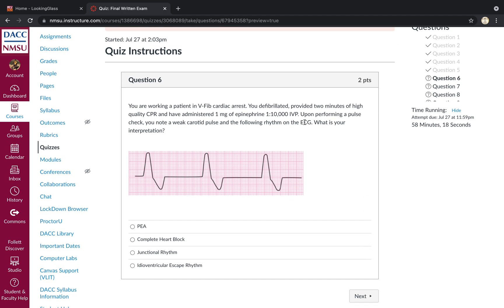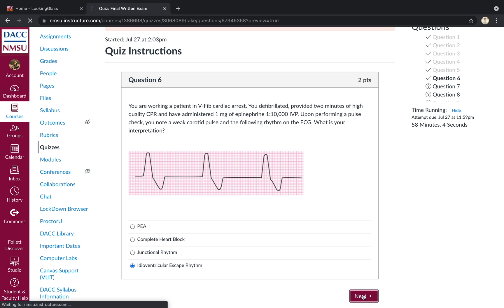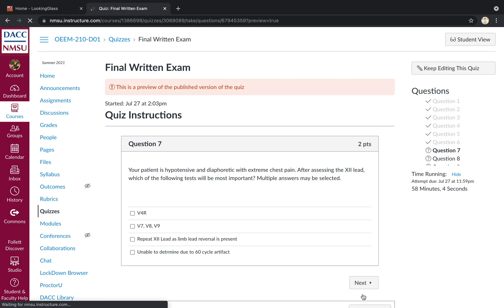V-fib arrest. You've defibrillated the patient, done CPR, given epinephrine. Perform pulse check. It's weak. So we've got a wide, organized, slow rhythm, not associated with P waves. That would be an idioventricular rhythm or ventricular escape rhythm.